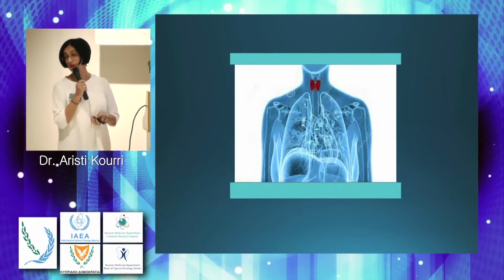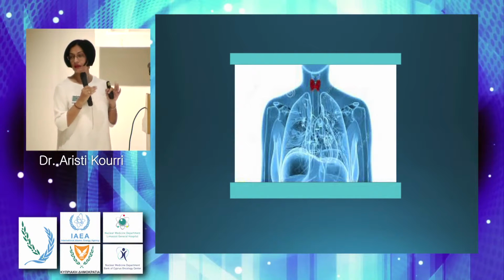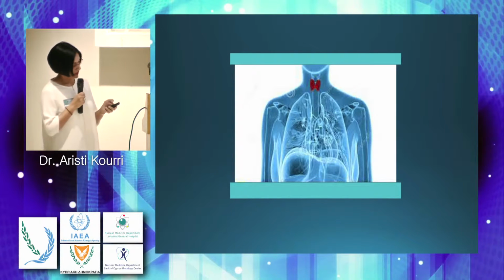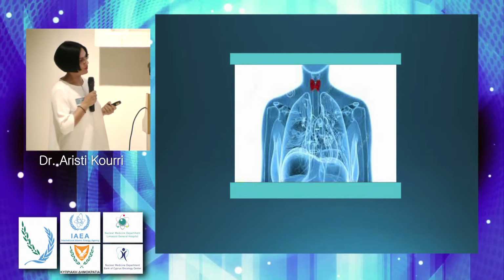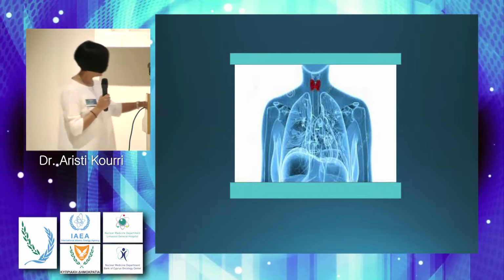Rena told you about our butterfly. This butterfly lies just above the manubrium of the sternum. And this is easy for us because when we look at it in the ultrasound, you just go right here, a little further up, and you found the thyroid.